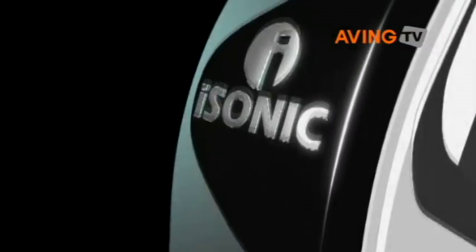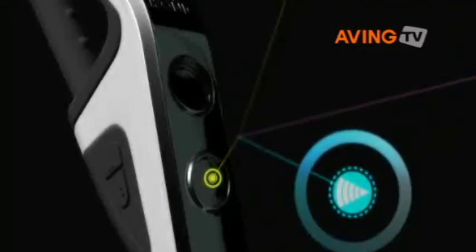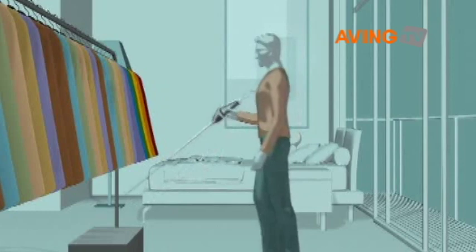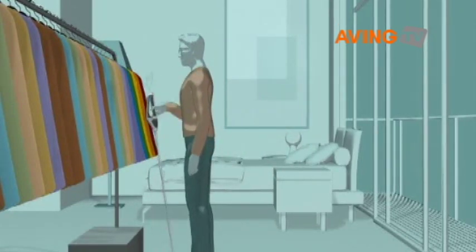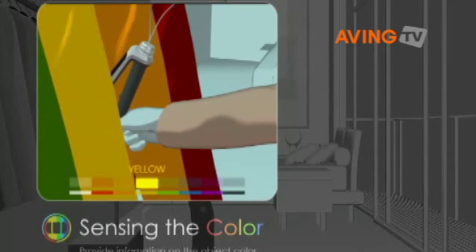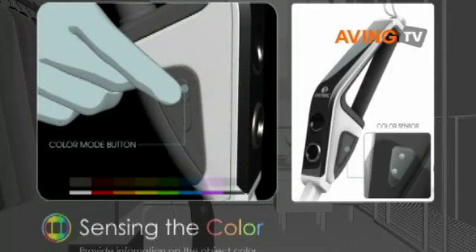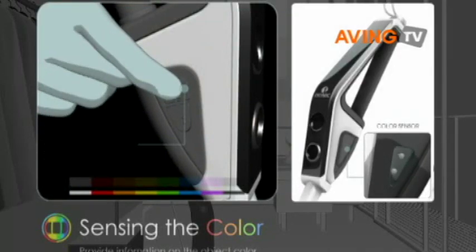Isonic is a revolutionary electronic cane for the visually impaired, while it keeps the basic function of a conventional white cane. Isonic mainly detects objects within 2 meters of the cane along the forward direction. When Isonic detects objects within the range, it delivers the information to users in the form of vibration. As objects get closer to the user, it vibrates stronger. In this way, Isonic could protect the visually impaired from unexpected accidents or other possible dangers.